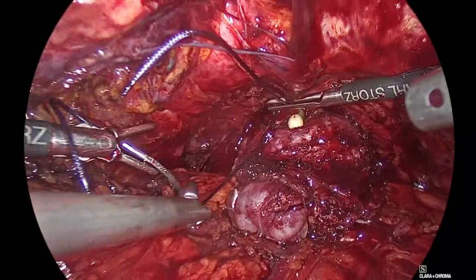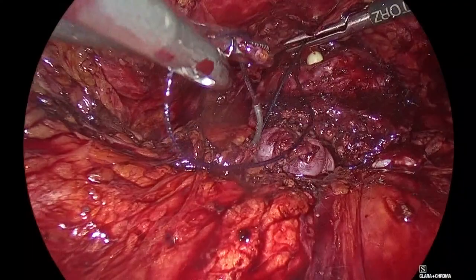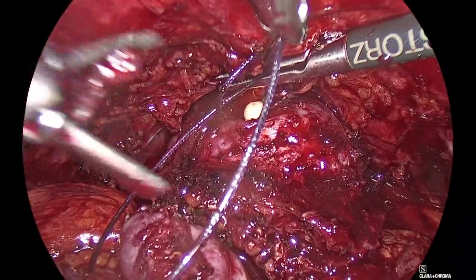So initially, when we started doing the laparoscopic prostatectomies, we used to put the suture in the beginning of the procedure. And this was not good because we used to grasp most of the sphincter. Come in, Padelis. Most of the sphincter, and it used to loosen up later on. So then it actually developed slowly.